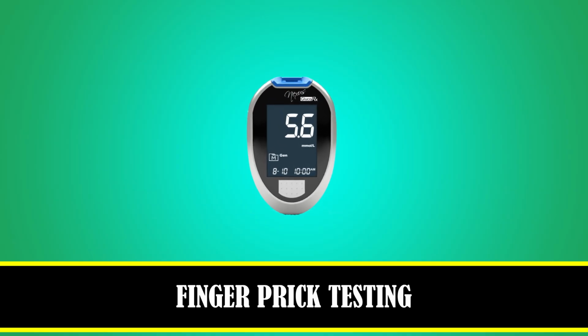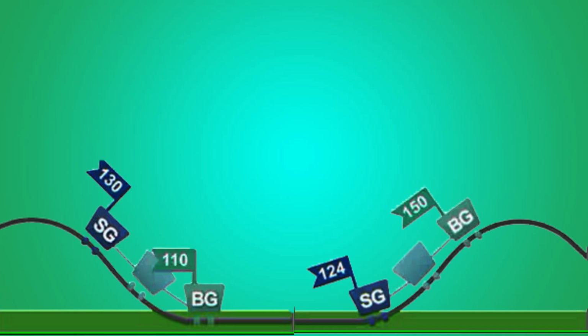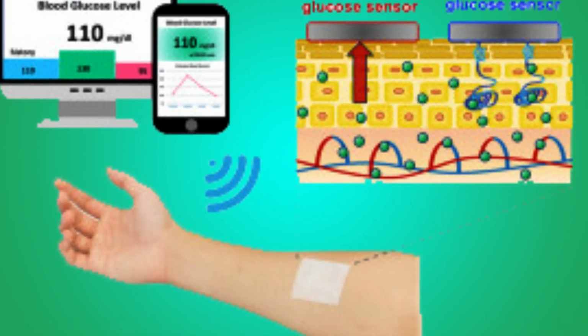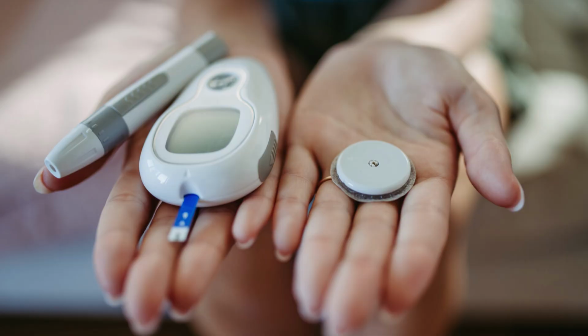The advantage of using the finger prick test is that it gives you an accurate reading of your blood glucose in real time, while the CGM tends to lag up to 15 minutes behind the actual blood sugar readings. And this is because while the finger prick test measures the sugar levels in the capillaries, the CGM measures the sugar levels in the fluid surrounding the cells. So what this means is that there will be situations where, while you're using your CGM, you would still need to use your finger prick testing for more accuracy.